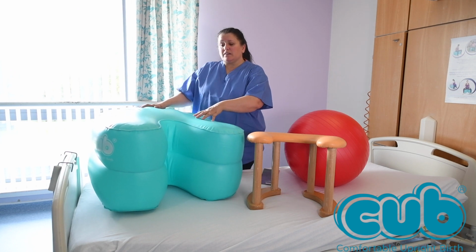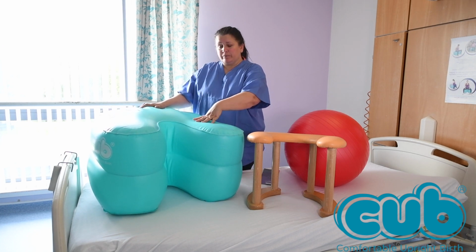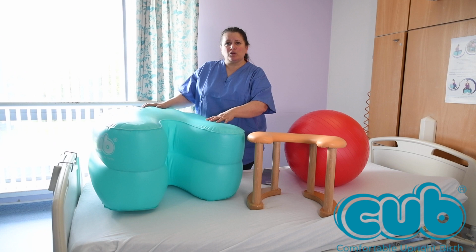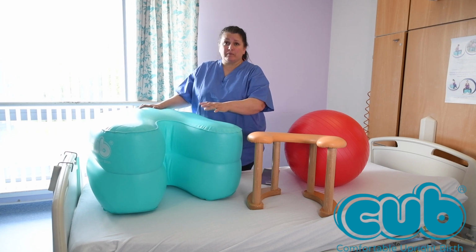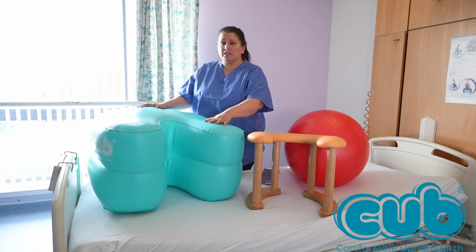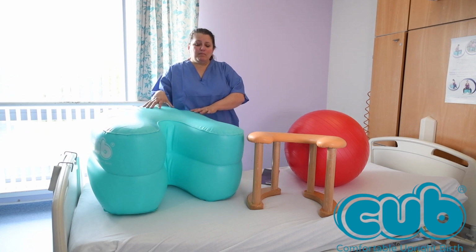There are also studies that have shown that the use of a birth cushion provides the optimal outcomes in terms of perineal integrity. And that tends to be what most people worry about with any kind of stool or upright position: are you going to cause more trauma? Studies have actually shown that no, you're not. But it depends on what kind of upright you are. Are you standing? Are you kneeling? Are you on a birth stool? Are you on a birth cushion? These are all things that influence it as well. So that's the main differences.